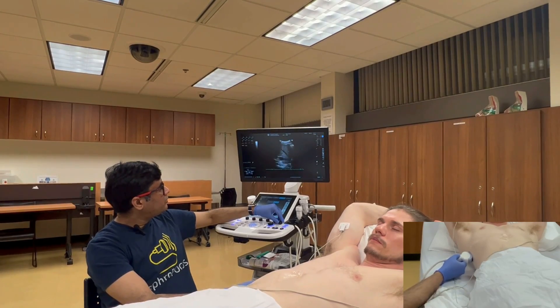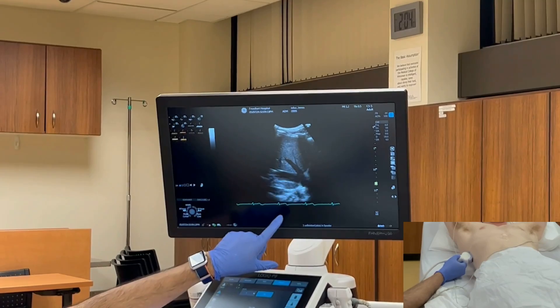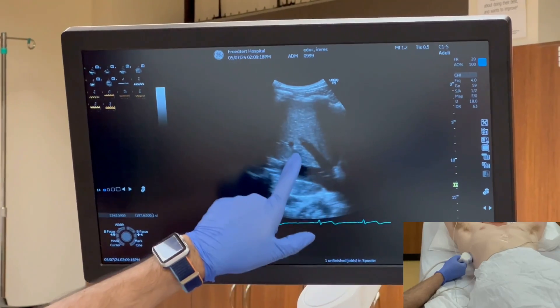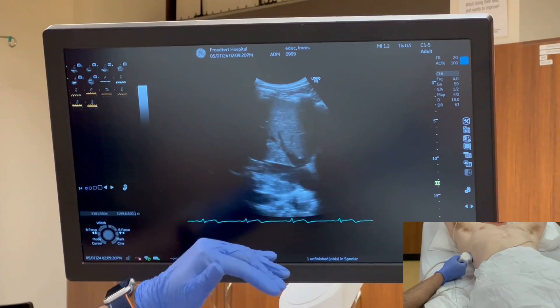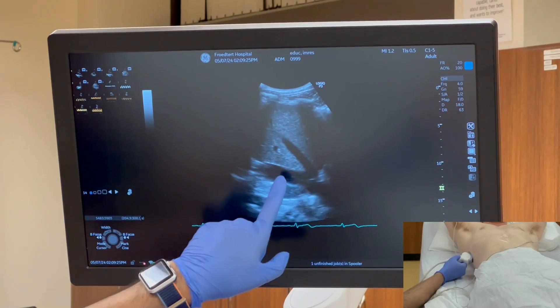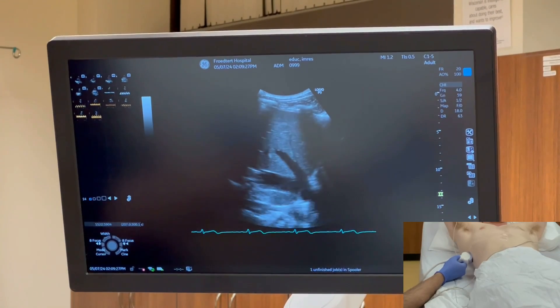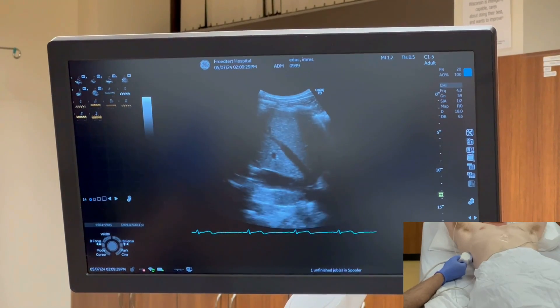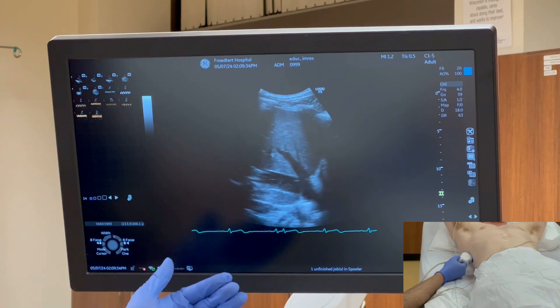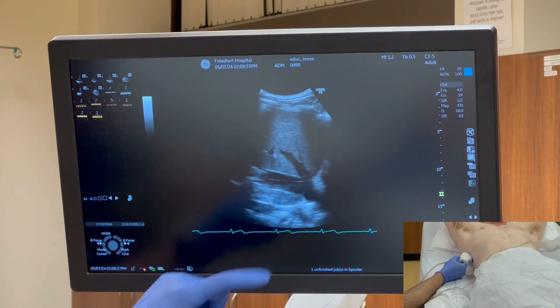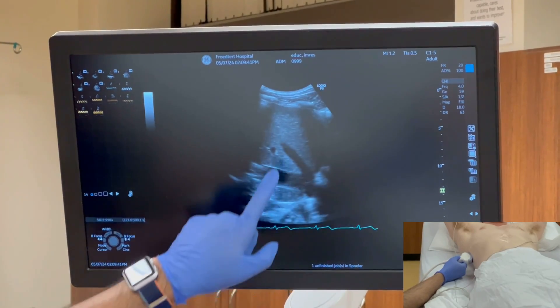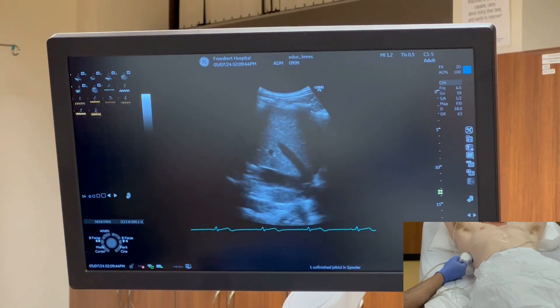I can see three vessels here. The vessel that is attached to the liver and closer to the ultrasound transducer is the inferior vena cava — we are looking at the side-to-side diameter, not the anteroposterior diameter. The vessel farther from the ultrasound beam is the abdominal aorta. This is called the double barrel shotgun view, with the IVC and aorta being the two barrels. Here you can see the hepatic vein joining the inferior vena cava.